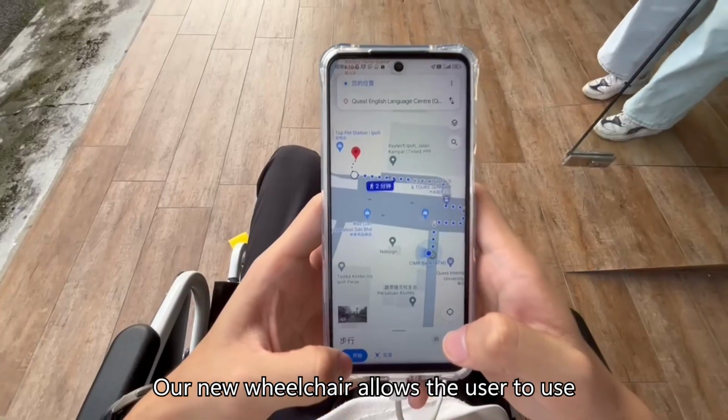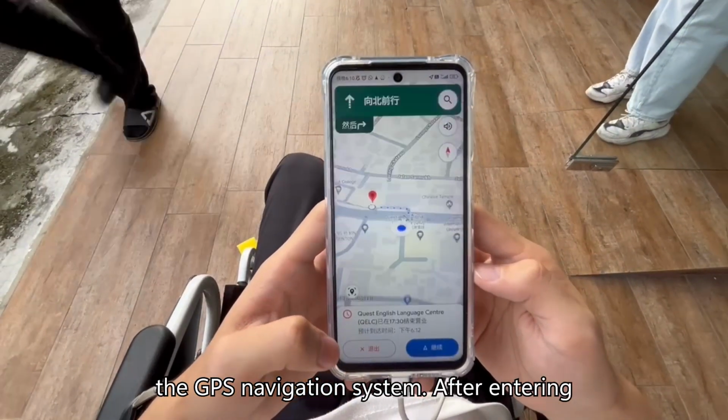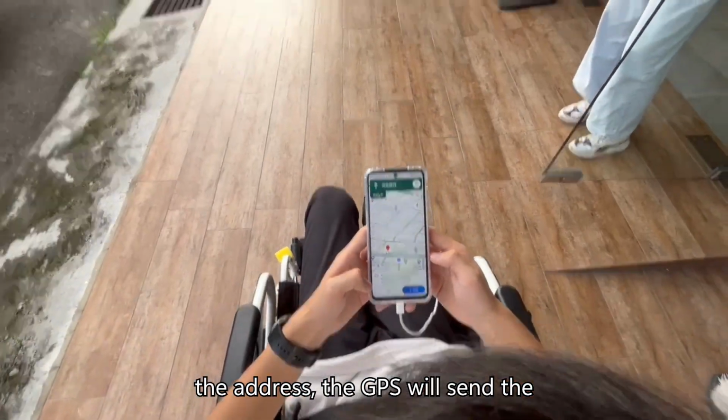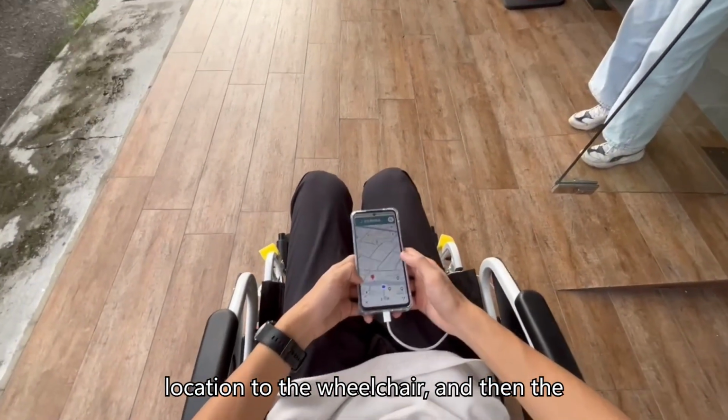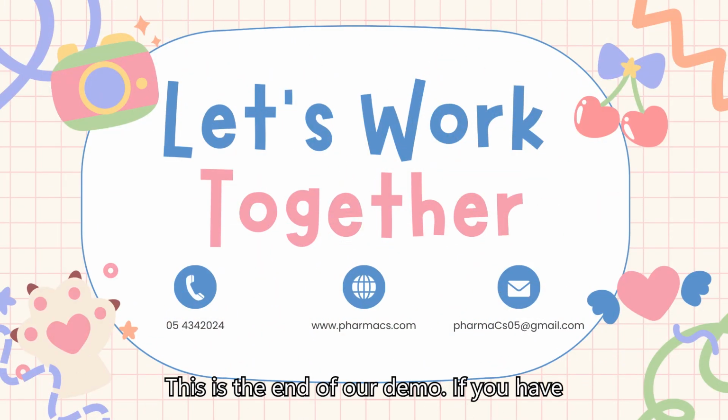Navigation. Our new wheelchair allows the user to use the GPS navigation system. After entering the address, the GPS will send the location to the wheelchair, and then the wheelchair will automatically move to the destination we set. This is the end of our demo.